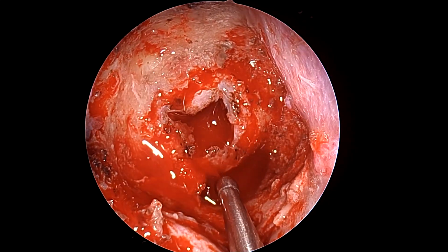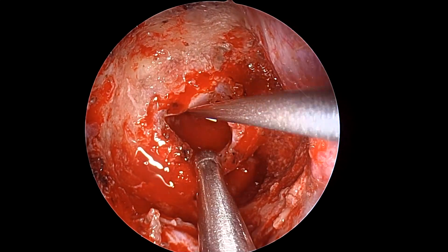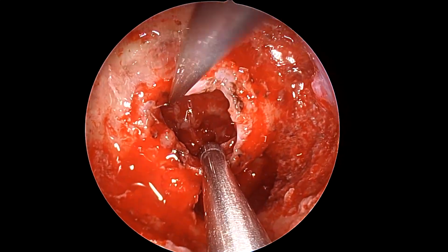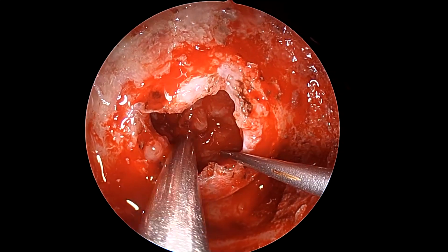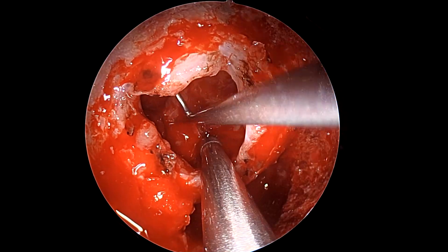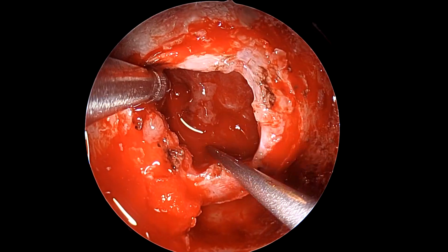the endoscope must closely follow the instruments for the surgeon who is holding the ring curettes, to have a good visualization inside the sellar cavity. And at any point of time when you feel that a certain part of tumor is too firmly attached, probably it could even be left alone, without any stubbornness to excise it.